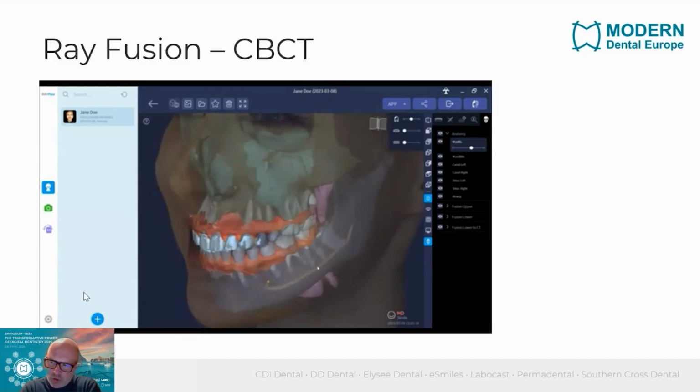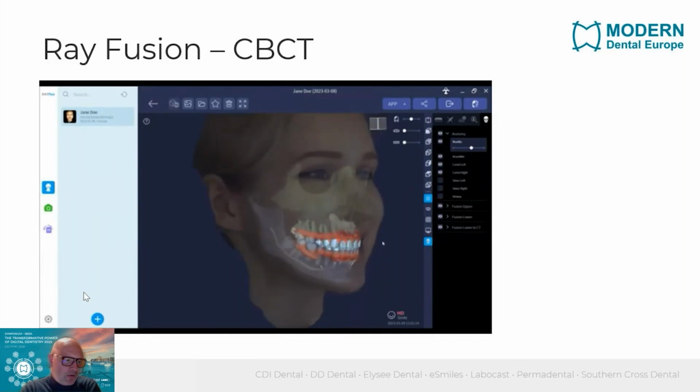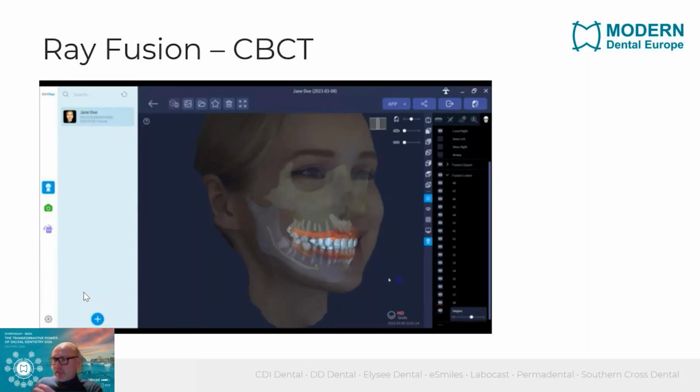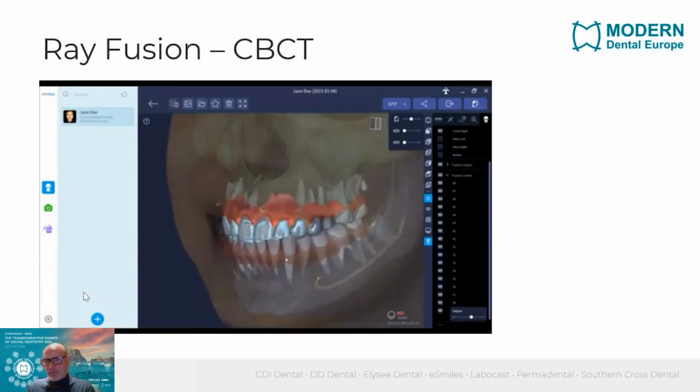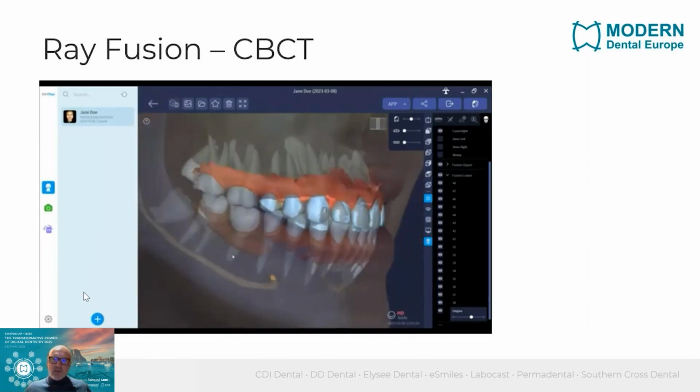So this is a little bit more, let's say, for high-end, maybe surgery, maxillofacial surgery, orthodontic osteotomies, for instance, where they can really prepare everything in this virtual environment, but also, of course, interesting to communicate on interdisciplinary treatment plans, for instance, between the surgeon and the orthodontist, or for instance, to prepare implant surgery.